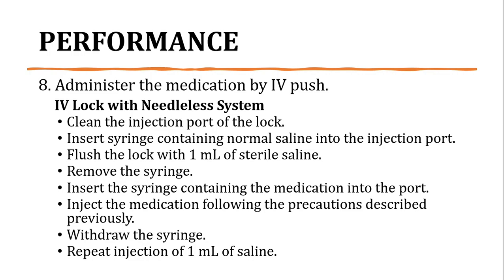Inject the medication following the precautions described previously, which is yun po na slowly lang po yung pag-administer ng medication and following the recommended rate of infusion ng medication based sa klase ng medication na yun. Then withdraw the syringe. Repeat injection of 1 ml of saline for flushing of the medication into the IV lock.